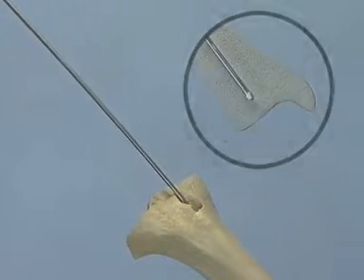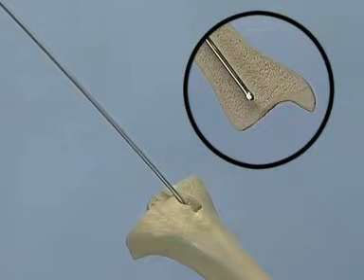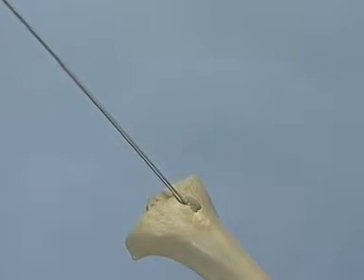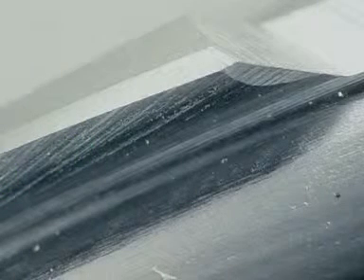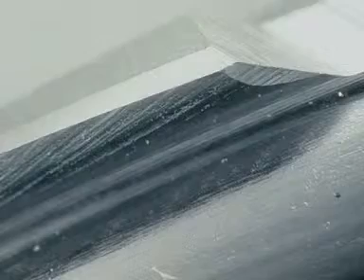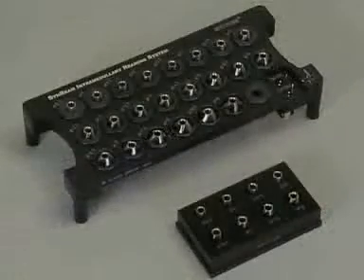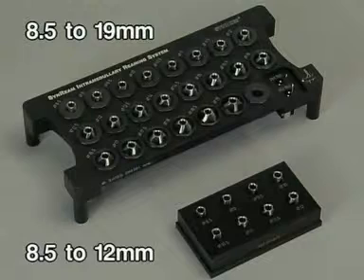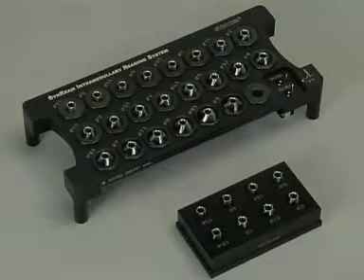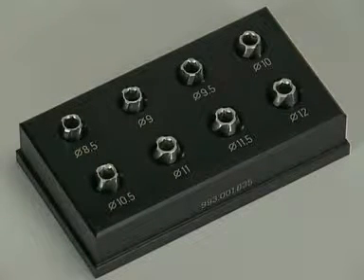In the clinic, passage through the fracture zone and the correct position of the nail are verified in two planes with the image intensifier. The reaming instruments consist of a flexible shaft and a set of reamer heads. Only reamers with sharp, undamaged cutting edges should be used. Reamers with damaged or blunt edges should not be used but replaced immediately, since they have a negative effect on the reaming procedure. In the clinic, reamer heads of 8.5 to 19mm are available. For this exercise, reamer heads from 8.5 to 12mm will be used. Because an 11mm diameter nail is needed, the canal will be reamed up to 12mm. For the first reaming, the 8.5mm reamer head must be used.